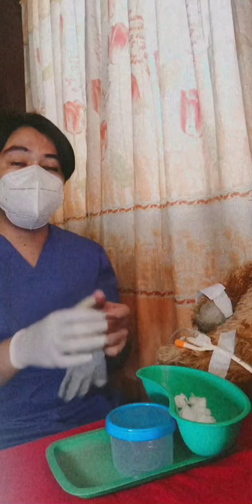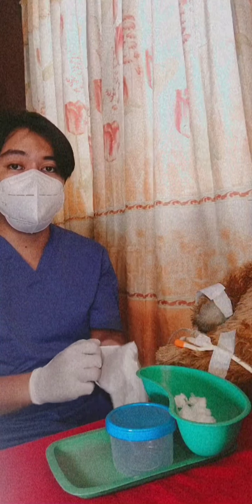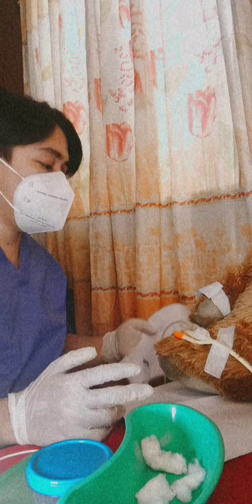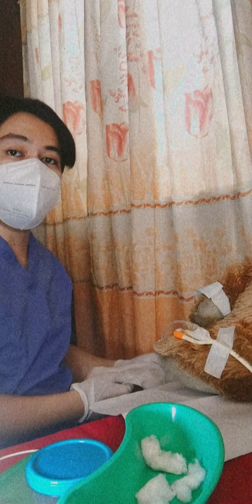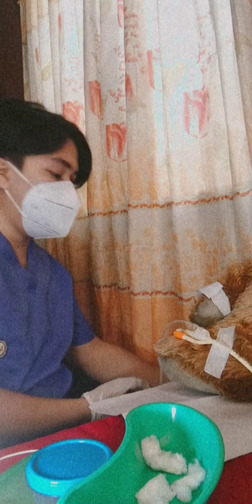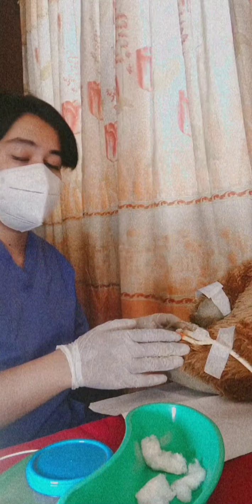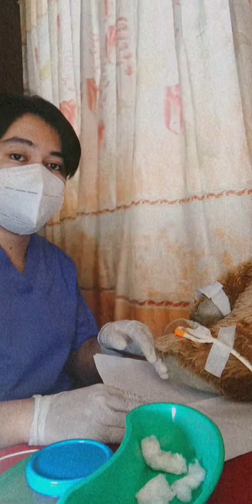And then also we need to adjust the bed to a comfortable working position. Next, we need to empty the drainage bag of the patient, then measure the amount of urine, and after that we need to expose the irrigation port and then place a waterproof pad below the patient.